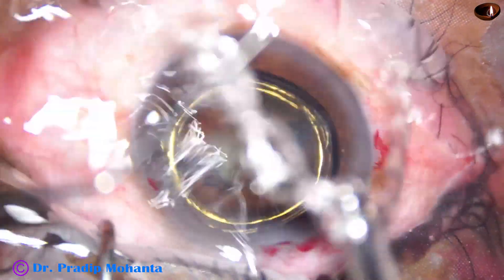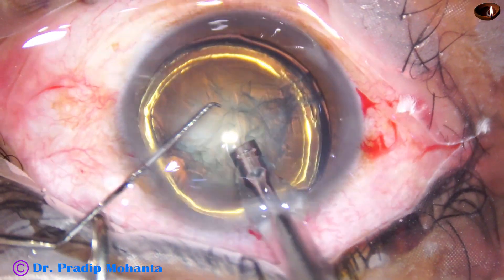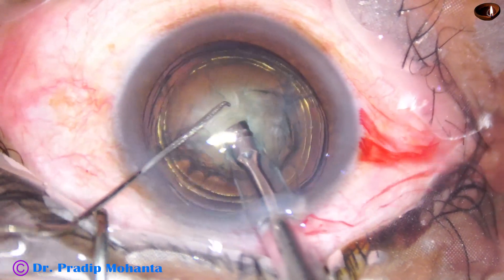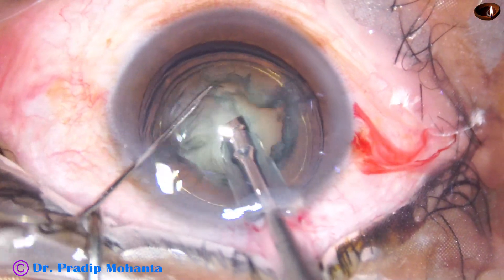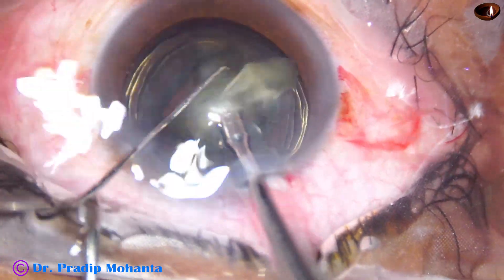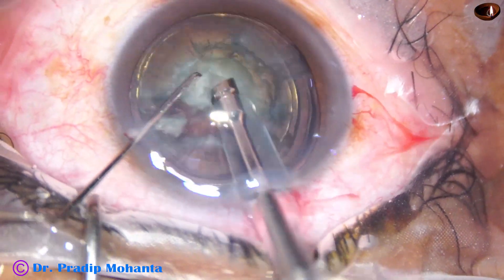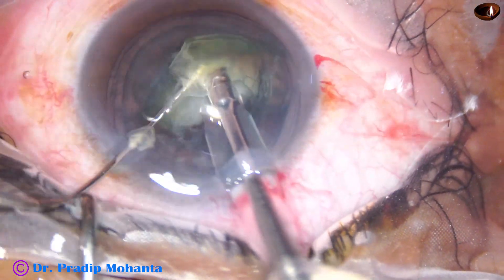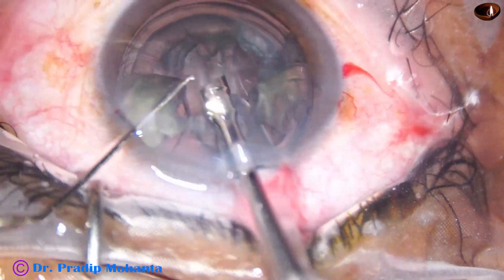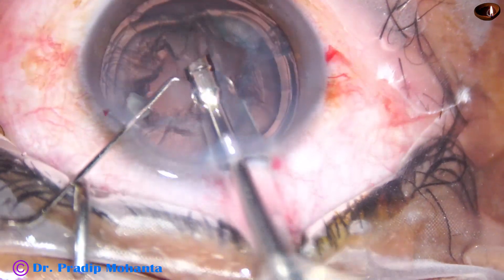Now we can see this cataract, which has about grade three nuclear sclerosis. He is going to do a direct chop. He makes two or three sculpts and then does the chop. A piece comes out and he emulsifies it. Then the rest of the lens mass is divided into pieces and in no time he manages the nucleus.